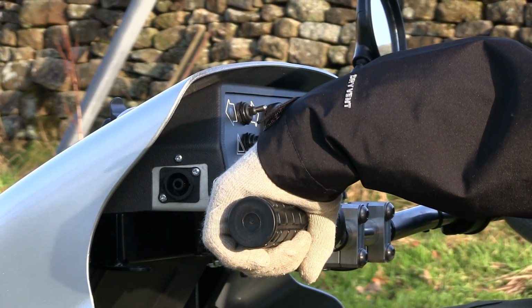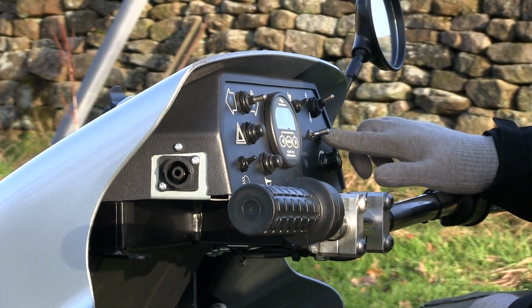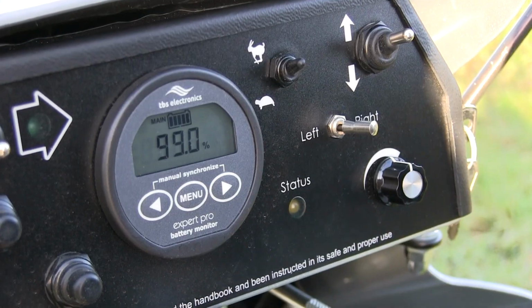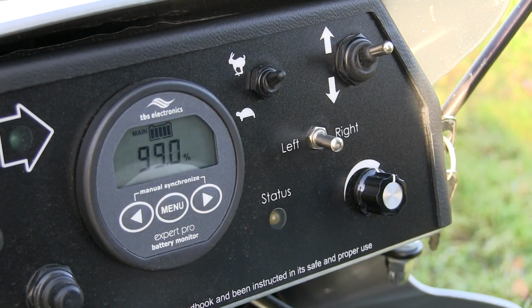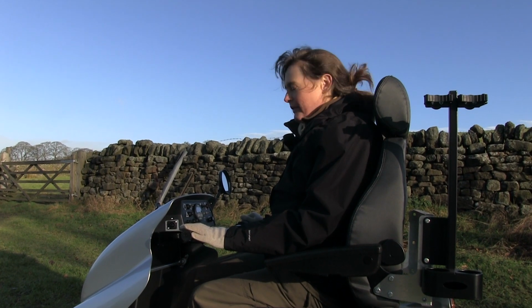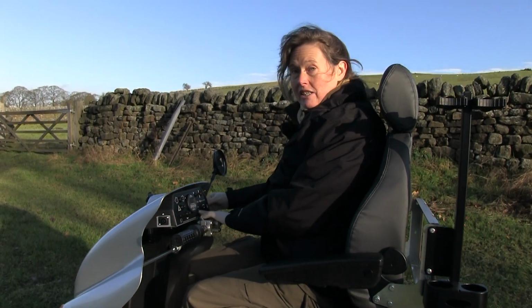Once you've decided whether it's to be left or right, there's a control on the dash which can be adjusted. It says left and right on it, and it's quite simply a matter of pulling the stick out towards you and either moving it to the left if it's the left grip, or to the right if it's the right grip. So when you're ready to move off, simply turn the key on the right hand side and the status light will come on.